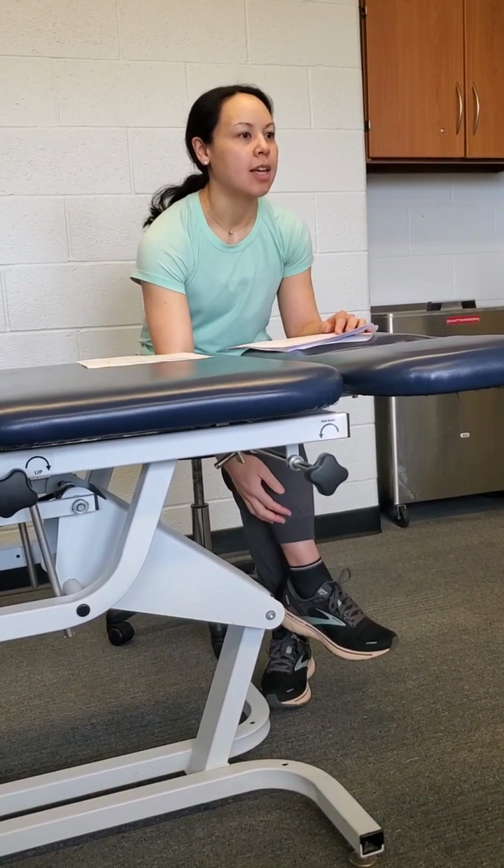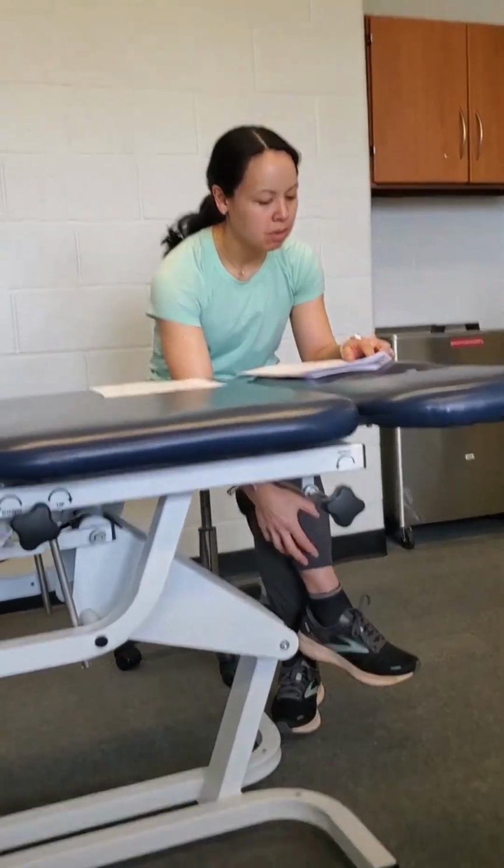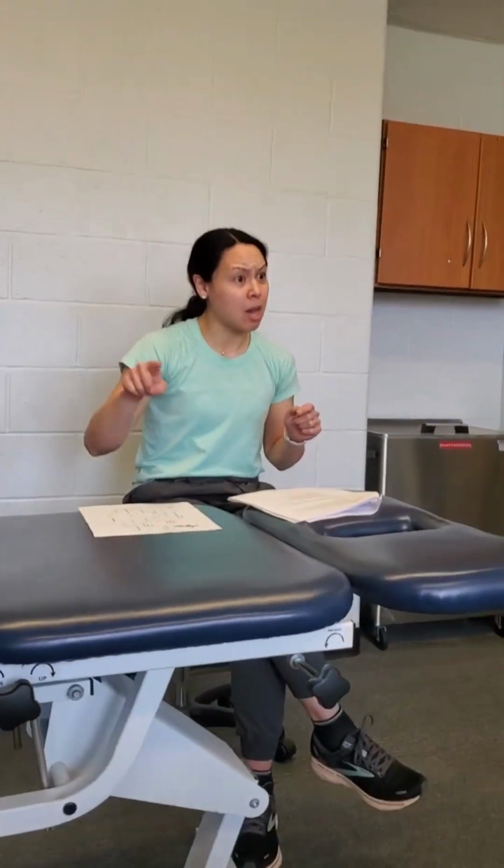Can I just ask a question? Absolutely. If by set 4 they can easily do 15 reps, would you just add more weight or resistance? Correct, 100%. You would note that so that the next time they come in, you start with a heavier weight. If they get through the 15 and could have done more, the weight was too light. So next session, whether they come in 2 days from now or next week, you want to start with a slightly heavier load. It could even be just 1 or 2 pounds depending on the patient's feedback.